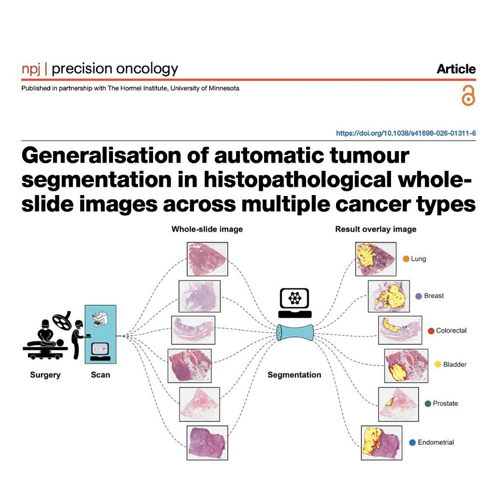So it uses distance-weighted overlaps. It blends the edges of the tiles together based on how close they are to the center of the grid. Which creates a massive, smooth probability heat map. And that heat map assigns a probability score from 0 to 1 for every single pixel, right? Right. 0 means the AI is certain it's healthy tissue. A 1 means absolute certainty of cancer.